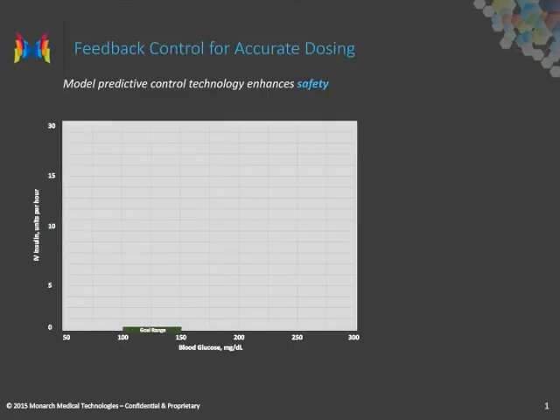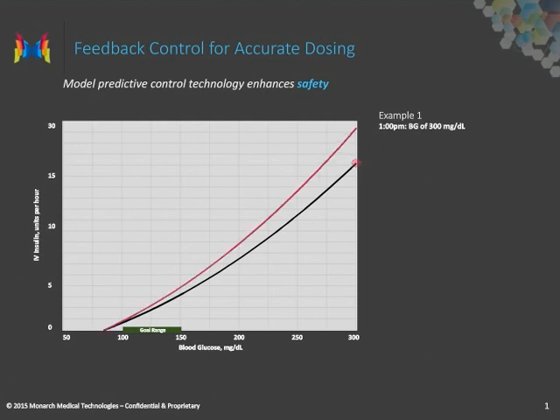After the initial model is calculated, the system determines dose adjustments based on specific patient response. For example, if the initial model for the patient calculated a dose of 18 units for a glucose of 300 milligrams per deciliter, and that patient's next glucose is 285 milligrams per deciliter, the system recognizes the response as inadequate, upregulates the physiologic dosing curve, and recommends a dose of 22 units.